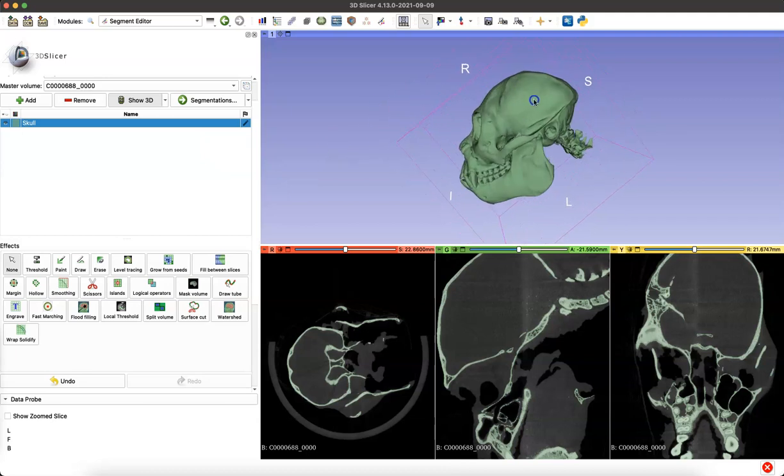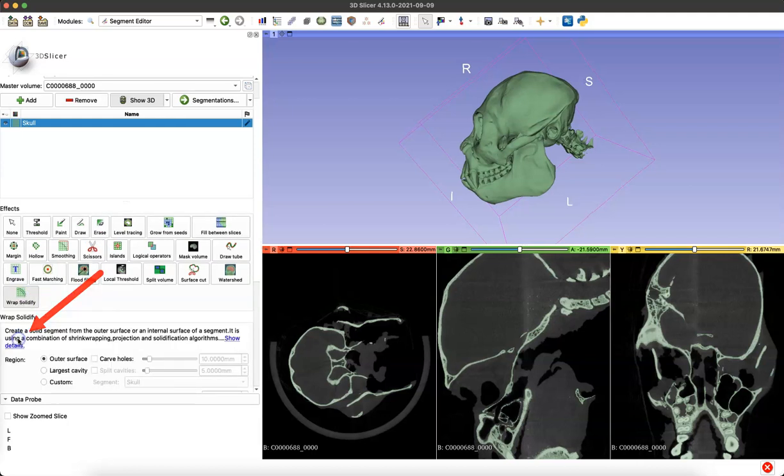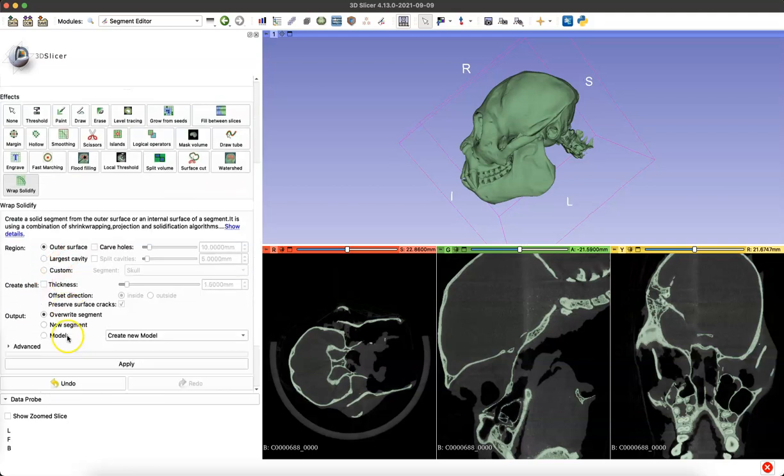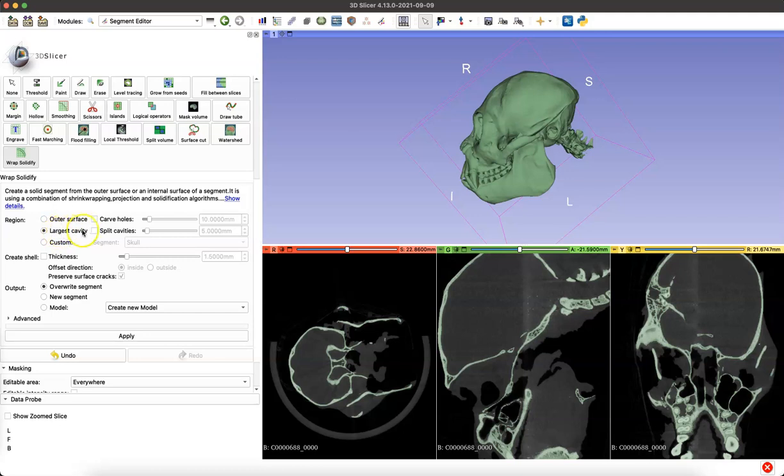As we're making an endocast, we'll first make it, do a little troubleshooting, and then complete the project. So we're going to go to the Wrap Solidify module, scroll down, and the settings you want to use are Largest Cavity, Split Cavities, and then down in our Output section, we'll click New Segment.